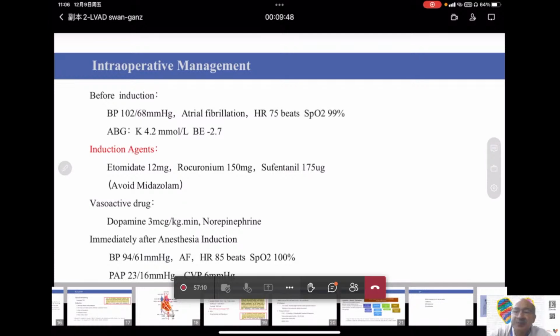Thank you, sir. Okay, I know what you mean. TAPSE is quite a limited parameter for the right ventricle because it only measures one point in the lateral wall of the right ventricle. The right ventricle is very complex in shape and volume. It's hard to use the EF or the TAPSE, or any single parameter, to measure the whole right ventricle function. We have to use them together. Thank you.